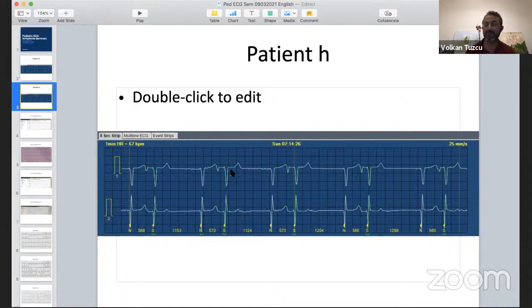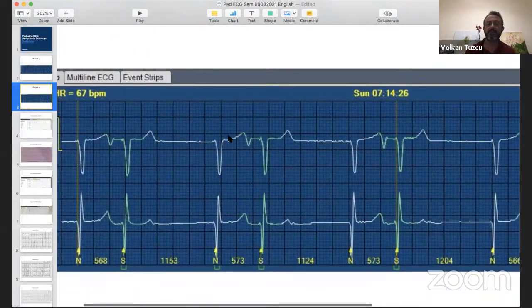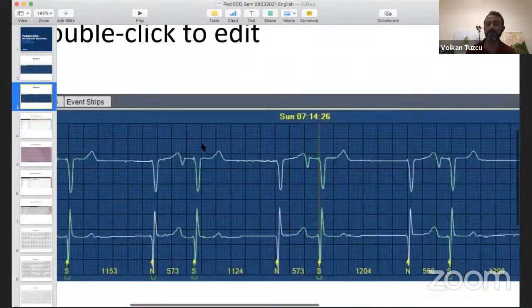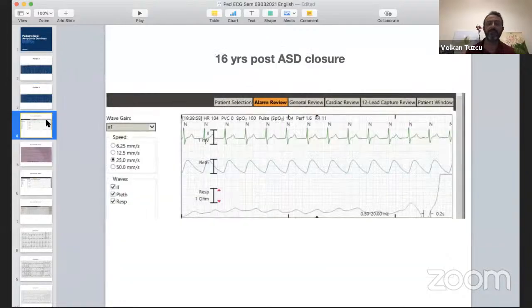If in the ICU we can atrially pace faster than this baseline rate, then we can know. Let's say this QRS would be narrow. Let's assume for a second, with these P waves, that's the junctional or whatever, we don't know, right? Let's say with these P waves, the following QRS was much narrower. Then our diagnosis would be ventricular escape rhythm, right? So these would be wider than this one. Then it would be, okay, the P is conducting with a narrower QRS. Therefore, this was not coming from the junction. So that would change everything. So somehow try to A-pace, or if the patient is able to jump around or do an exercise test, one way or other, you can accelerate the atrial rhythm, okay?